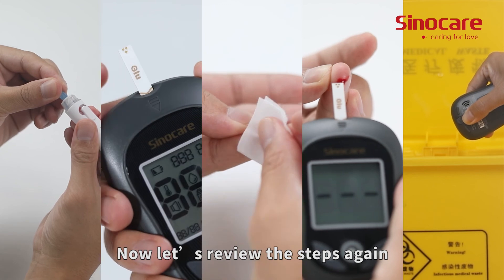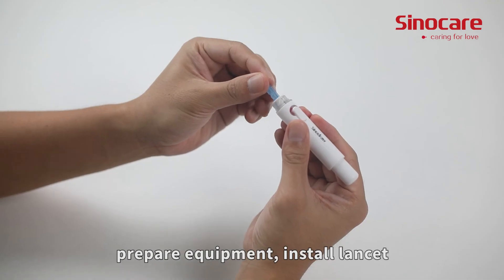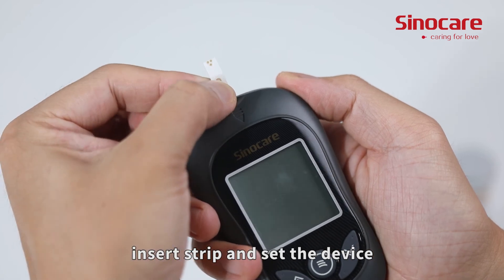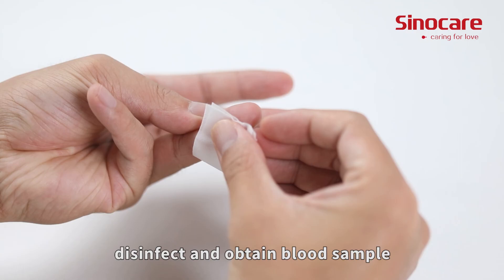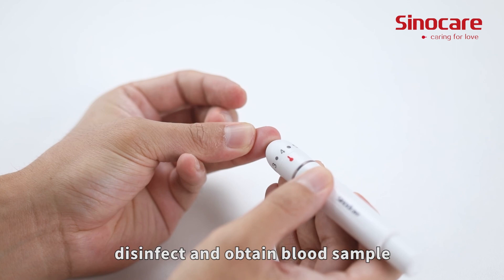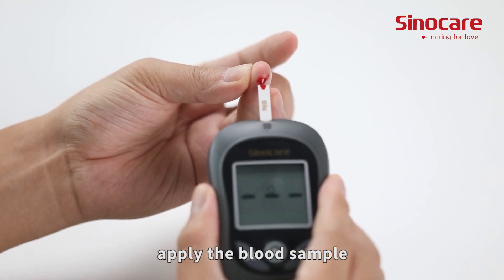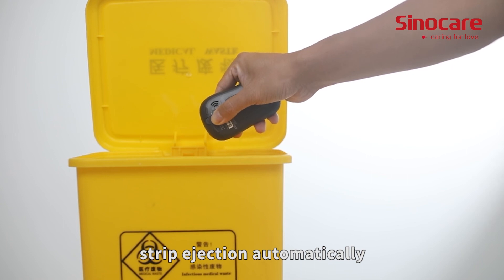Now let's review the steps again: prepare equipment, install lancet, insert strip and set the device, disinfect and obtain blood sample, apply the blood sample, and strip ejection happens automatically.